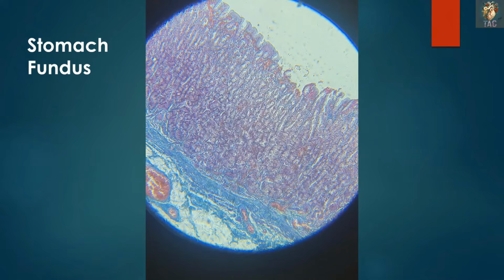So this is the slide at higher magnification of the fundus of the stomach, and over here you can see the total thickness of the mucosa.